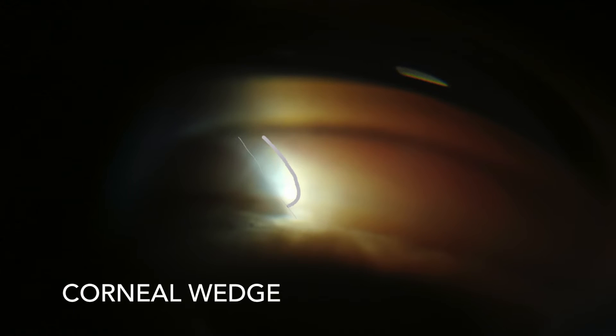The corneal wedge is a technique that helps the examiner identify the anterior border of the trabecular meshwork in patients where the border is difficult to see, either because of a lack of pigment or because of excessive pigmentation. You do this by making the slit lamp beam very thin and bright, and offset the oculus. Through the gonioscopy lens, the thin slit of light appears as two lines — one that strikes the surfaces from the inside of the eye, crossing the iris and the angle. The other line, which looks broader and fuzzier, is created by the slit of light striking the external cornea. That second line curves in along the interface between the cornea and the sclera at the limbus, to meet the first line at the anterior edge at Schwalbe's line, thus making it clear where the cornea ends and the meshwork begins.